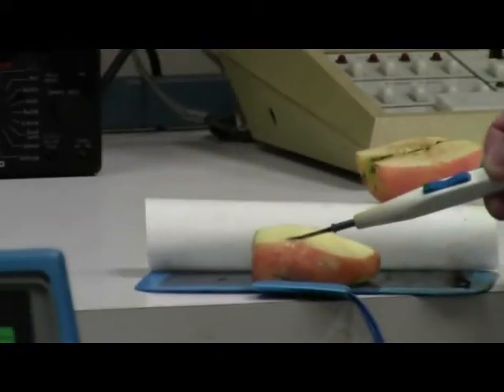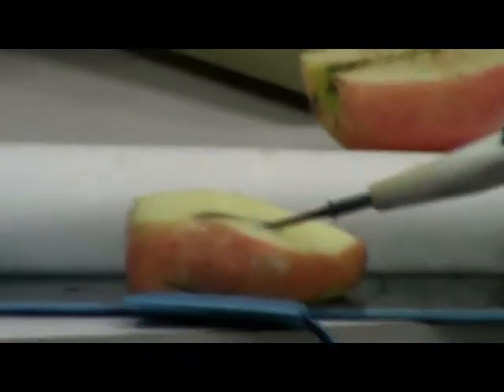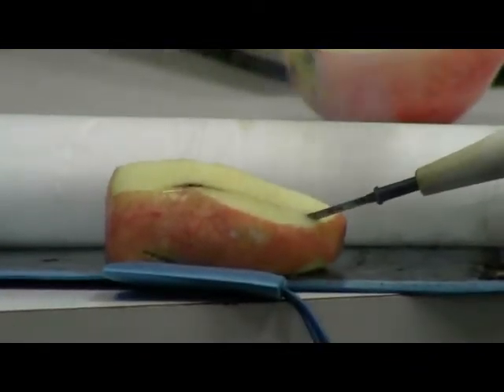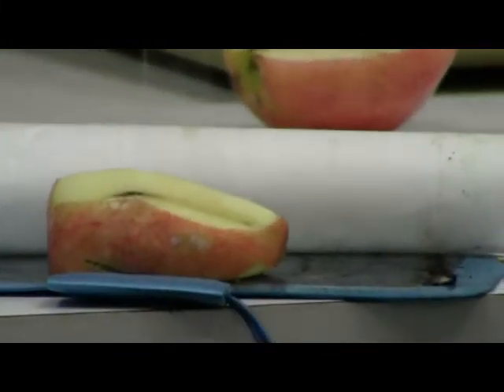Now you can actually see where it's cutting into the apple — it's kind of steaming and cutting through. This would be used on an actual patient to cut and remove tissue.